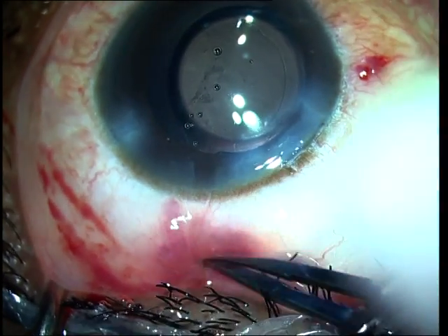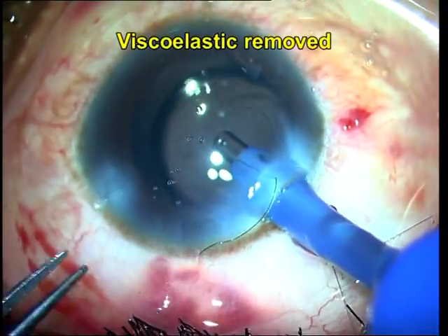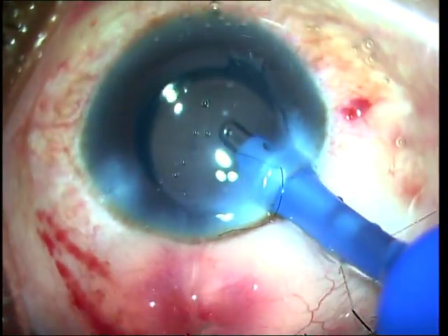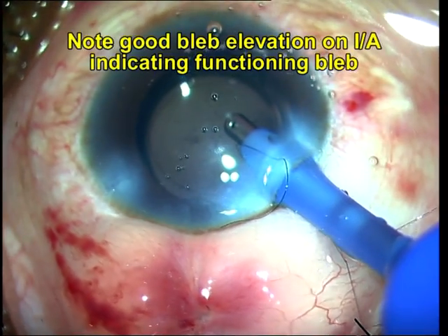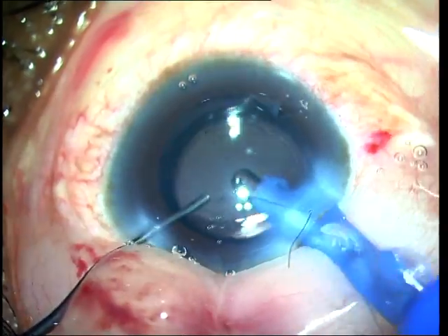On passing the IA probe into the anterior chamber, you can see a physiological hydrostatic expansion of the sub-conjunctival spaces causing a formation of the bleb, or a good ballooning of the bleb, which is an indicator for post-operative success.